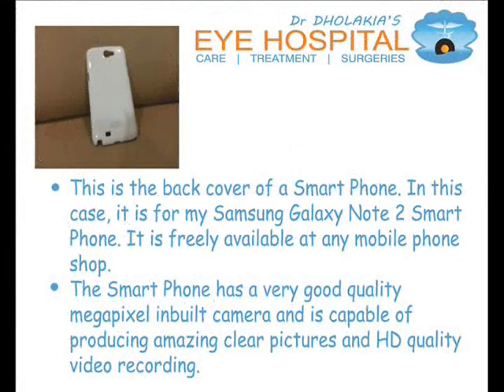This is the back cover of a smartphone — in this case, it is for a Galaxy Note 2 smartphone. It is freely available at any mobile shop. The smartphone has a very good quality megapixel inbuilt camera, and is capable of producing amazingly clear pictures and HD quality video recording.